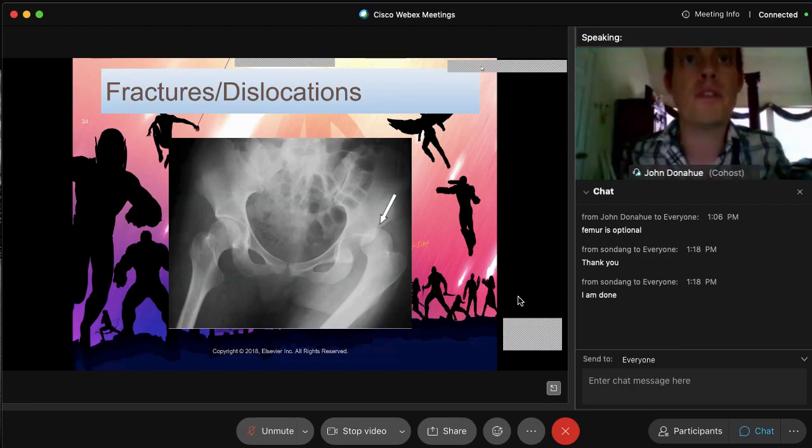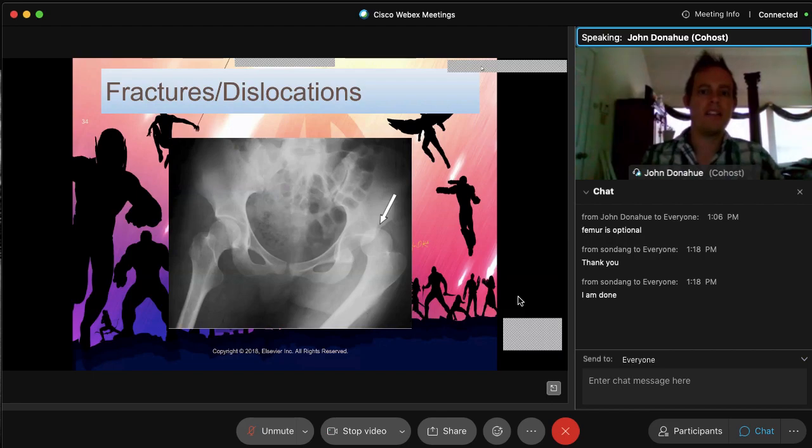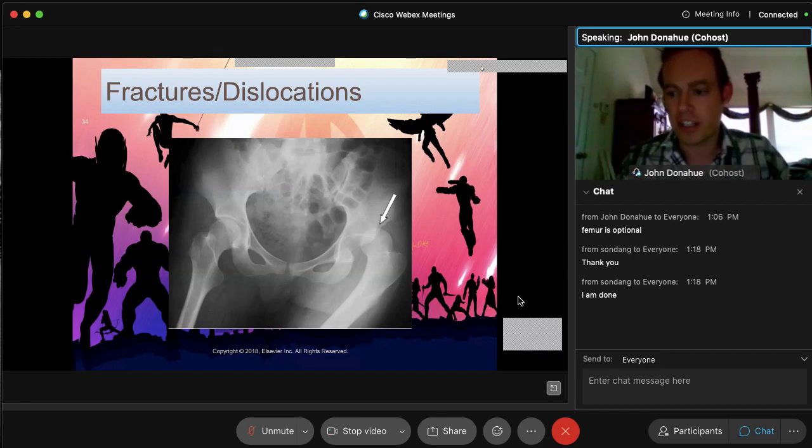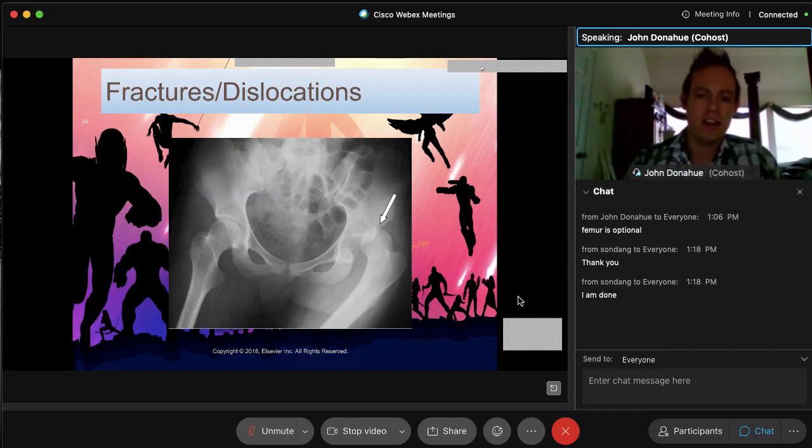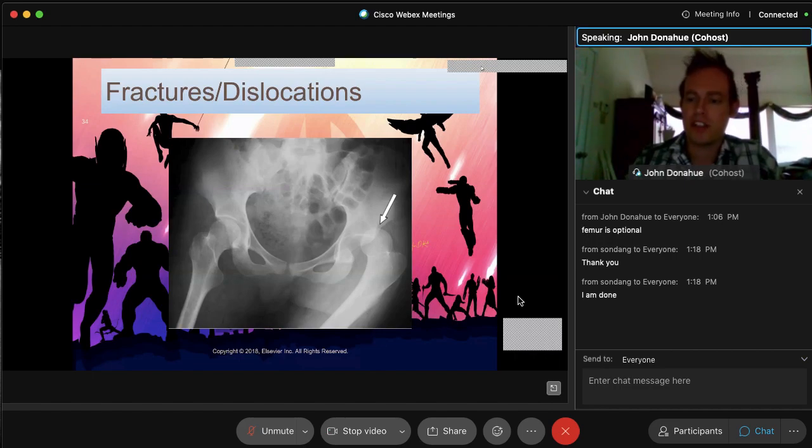All right, guys. So when last we left off, we were just showing some of the kinds of fractures you can expect when it comes to hip and pelvis x-rays. Talked a little bit about dislocation, which you see right there.